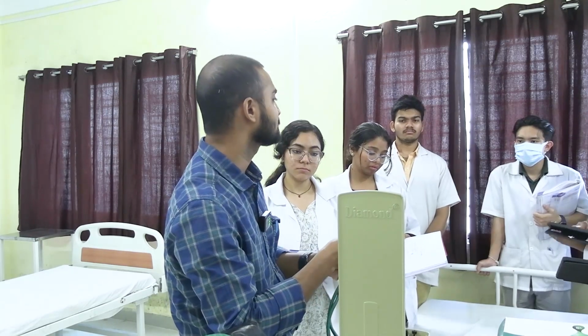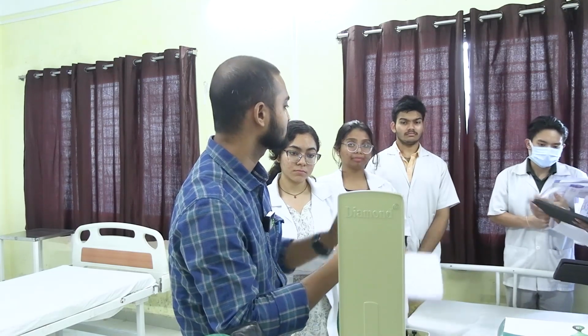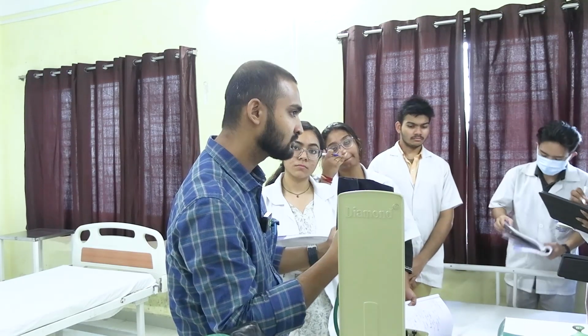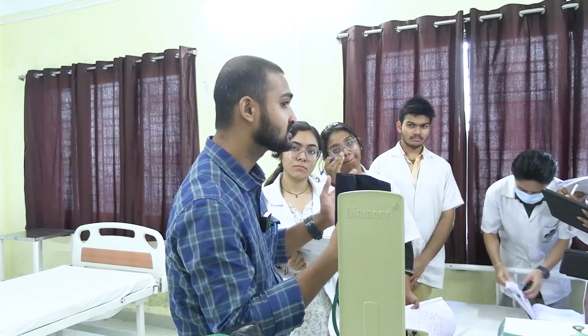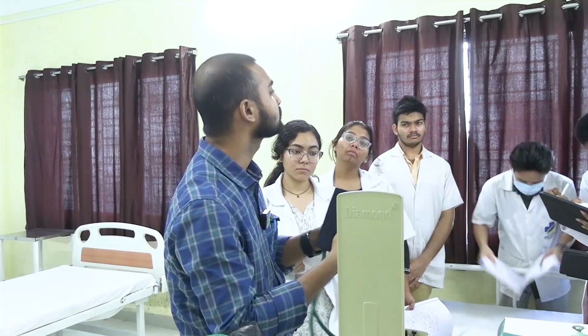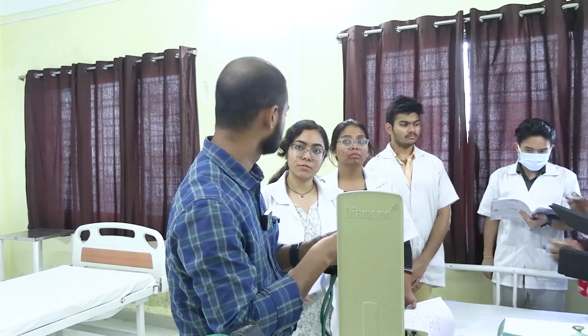So what about the procedure? There are two procedures. You can measure the BP of a patient or a person either in lying down condition or in sitting position. Okay, in supine position or in sitting position. So who wants to be the subject?